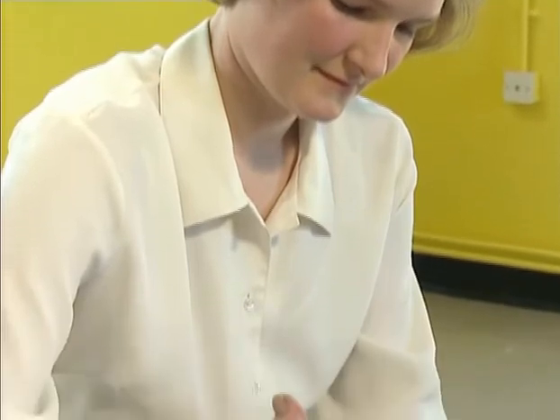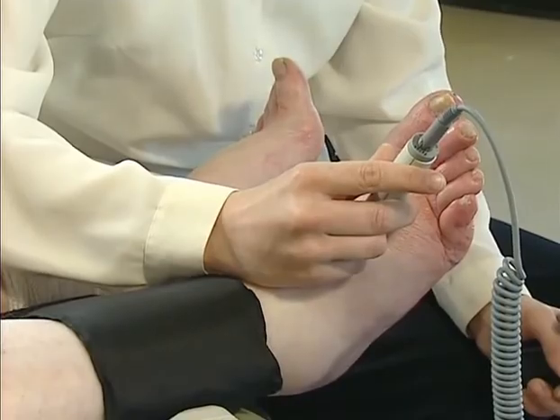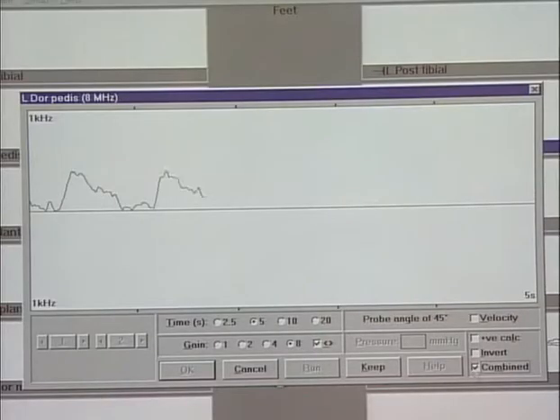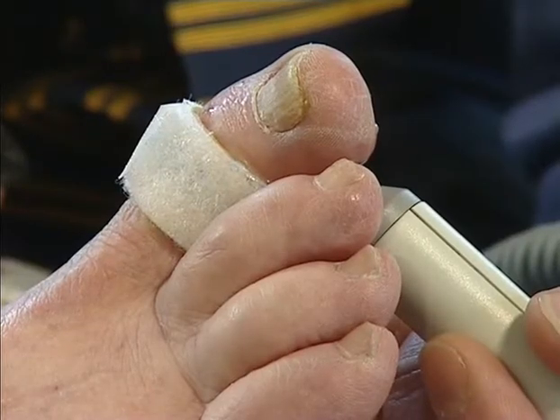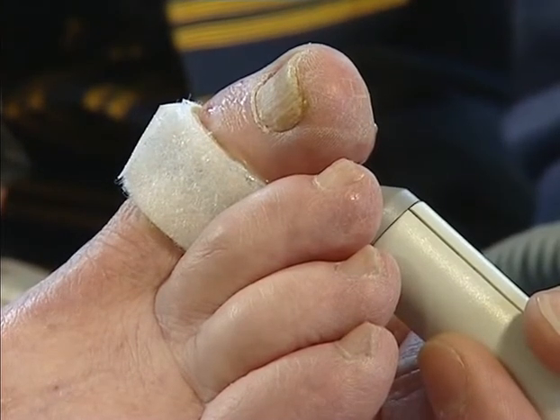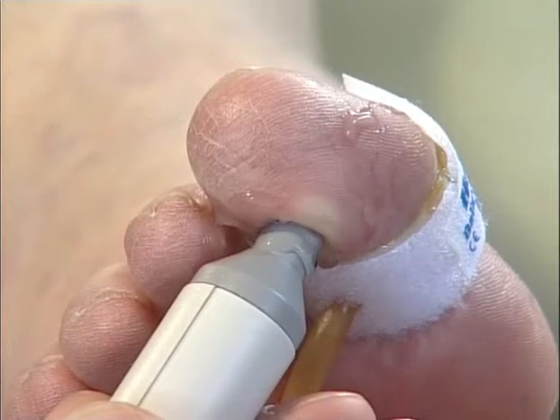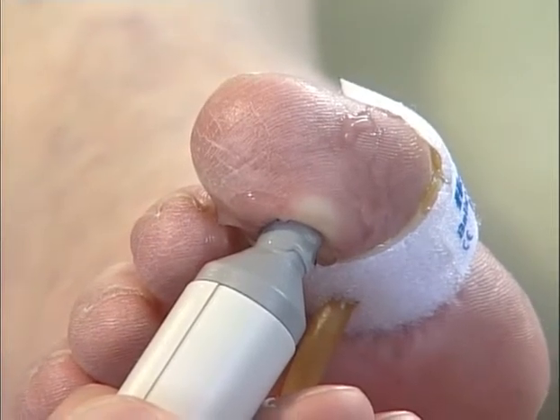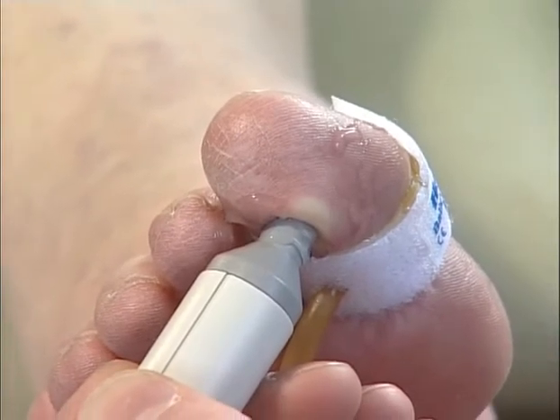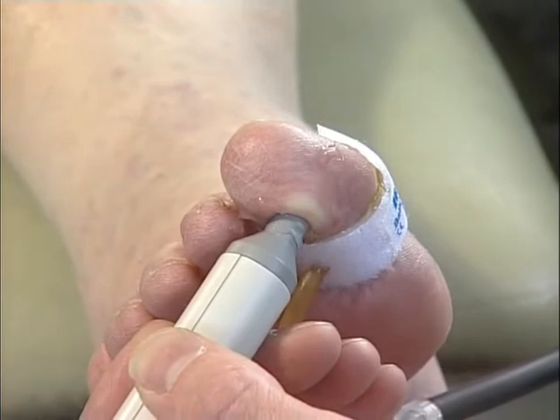If observations indicate ischemia, but this is not reflected in the ABPI measurement, suspect calcification. The Doppler signal is likely to be monophasic. Digital arteries are generally spared of calcification, so, if possible, toe pressures should be taken. By placing an appropriate sized toe cuff around the base of the big toe, and using the Doppler probe on the digital artery, a toe systolic pressure can be determined.